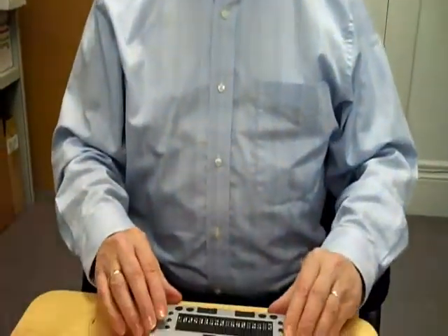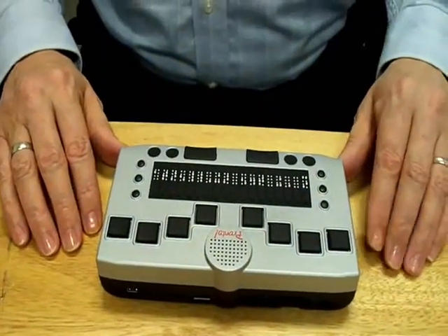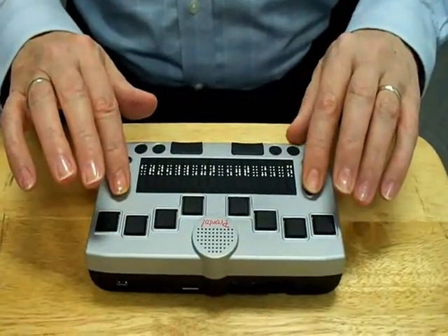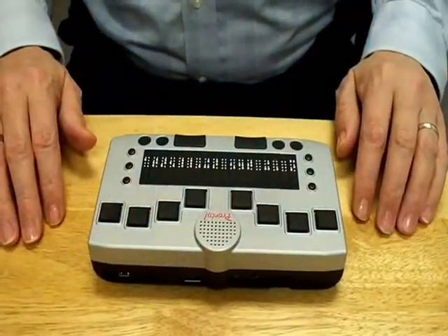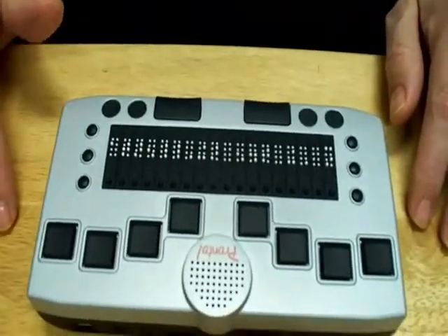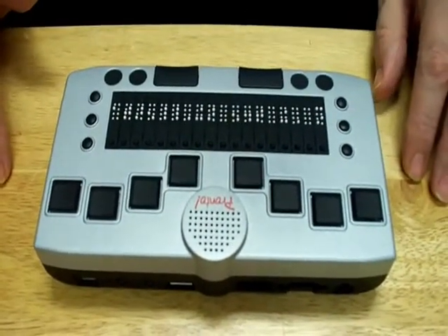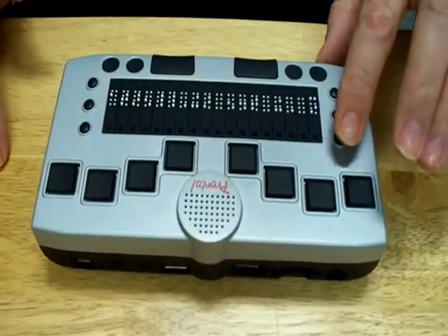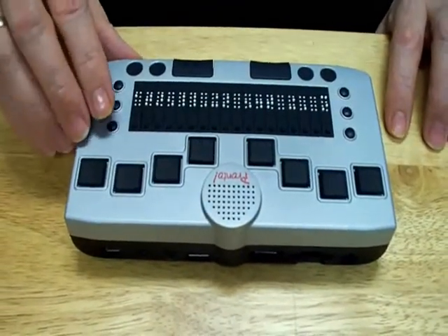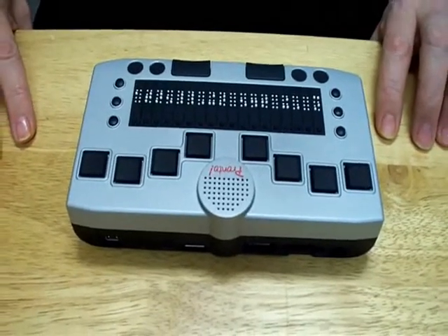Let's begin with the top surface of Pronto, and you'll notice that at each end of the Braille display where my fingers are, there are 3 buttons. These are referred to in Pronto manuals and when we talk about Pronto as the D keys. They're called D keys because they correspond to Braille dots. So on the left side you would have dot 1, dot 2, dot 3 going from top to bottom. On the right side you have dot 4, dot 5, dot 6. So these are the D keys.